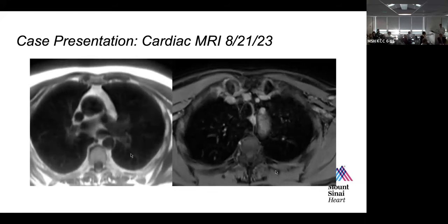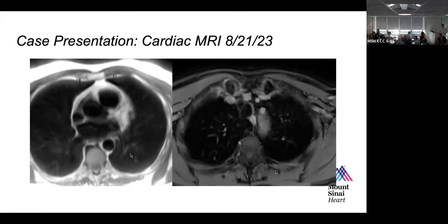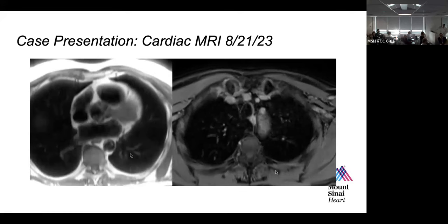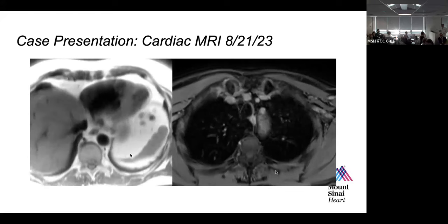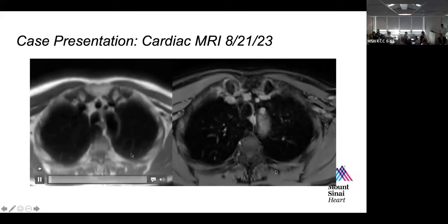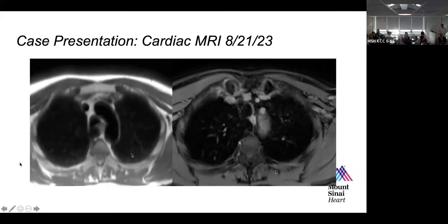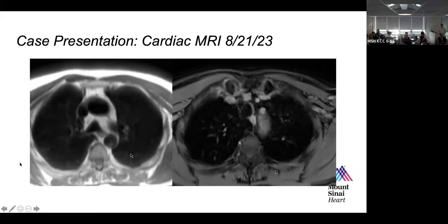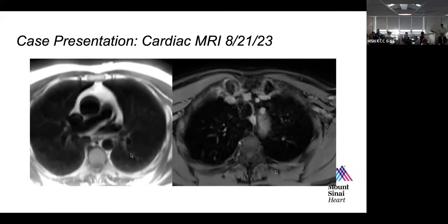Well, you want to orient the people. Yeah, so these are both axial views, and we're starting kind of at the top of the chest, and we're moving our way down in thin, or maybe not too thin, but in thin slices. What's the thickness of the slices? I think the black blood is pretty thick. I'm not exactly sure. Maybe it's 8 to 10. 8 to 10.